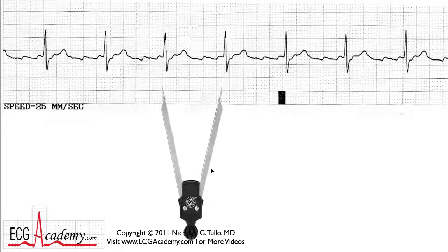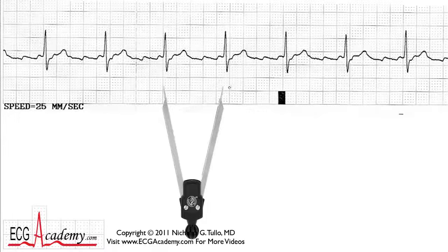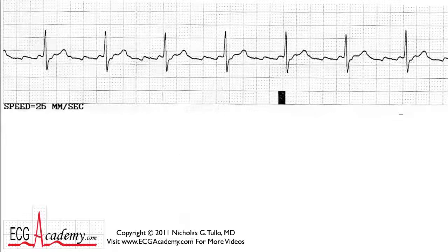What's the rate? If we count heavy boxes: 300, 150, 100, 75, 60 — it's between 60 and 75 beats per minute, so we'll call it 68. So we have a regular rhythm at 68 beats per minute.